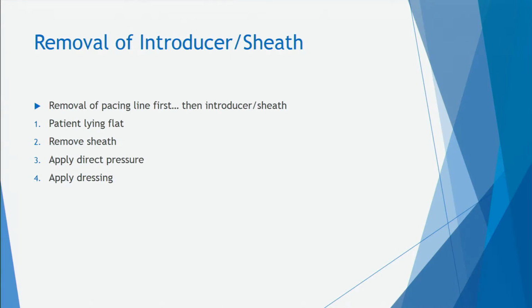Yes, they call it an introducer or a sheath or a cordis. I think introducer is the general term, and cordis is the brand name. But anyway, it's a little bit smaller than this actual traditional cordis, the kind you would have with a Swan. I do think the goal is eventually for y'all to be taking these out. And they may even go to the floor with this, and the physician would remove it on the floor if they kept it in place.